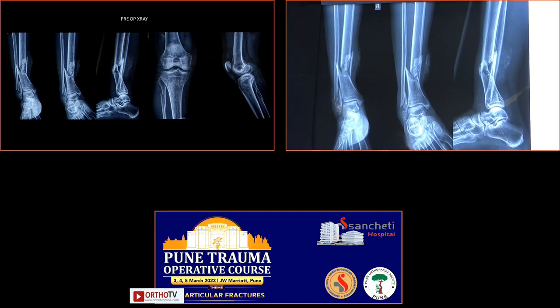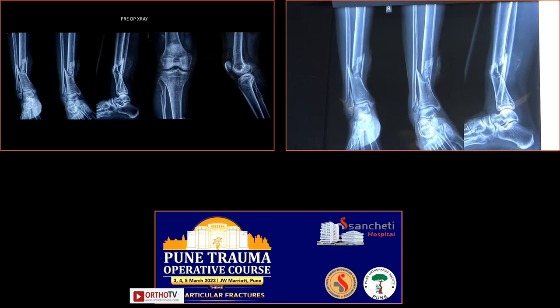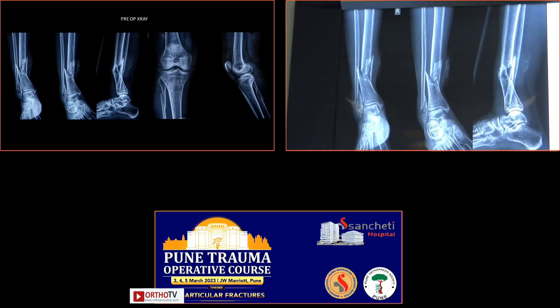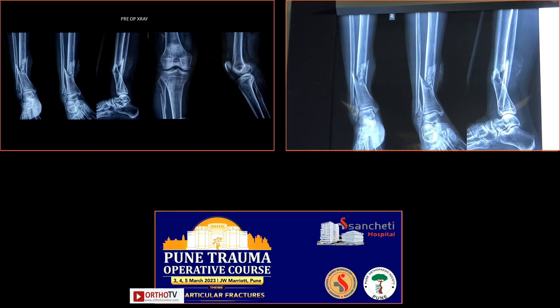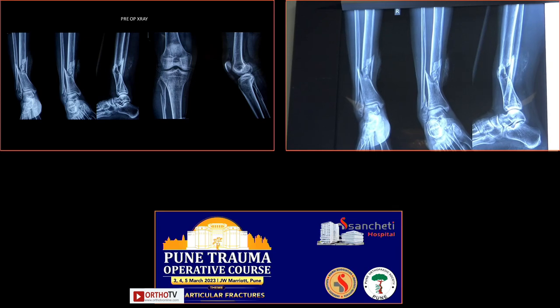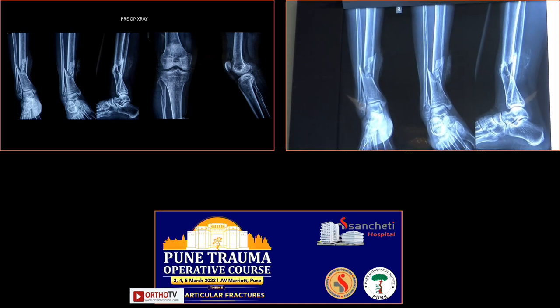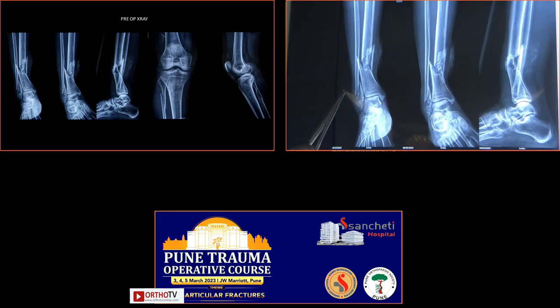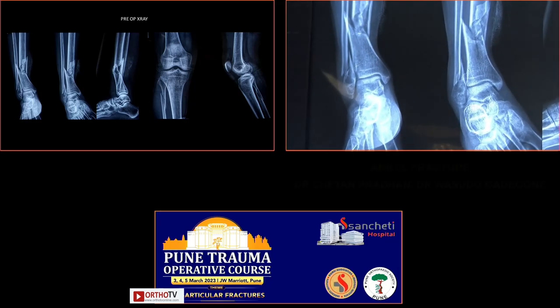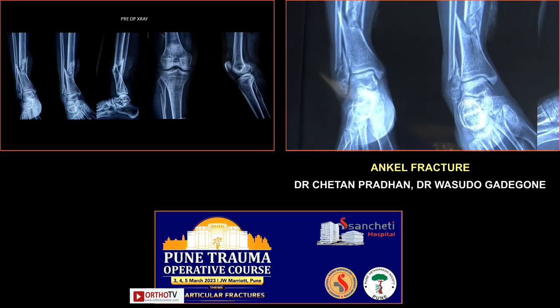Okay, let me stop you there. This fibula is a segmental fibula. Even if you fix lower down, do you think you can stretch it out to length? Yeah, at the fracture zone, it will definitely help alignment. And the second reason for fixing the fibula is that it is within 6 centimeters of the ankle mortise. As you can see here, it is almost at the syndesmotic level that the fracture line is there. Therefore, we will need a fixation of the fibula in this case.